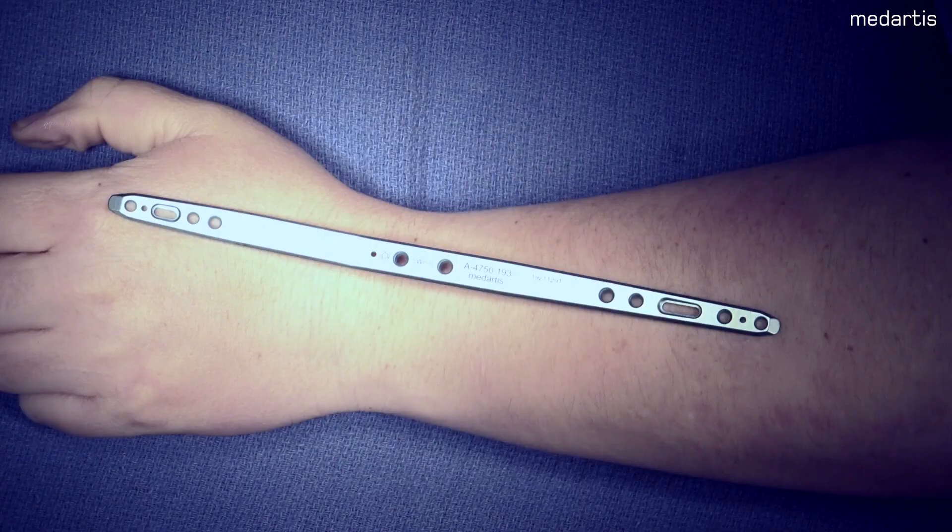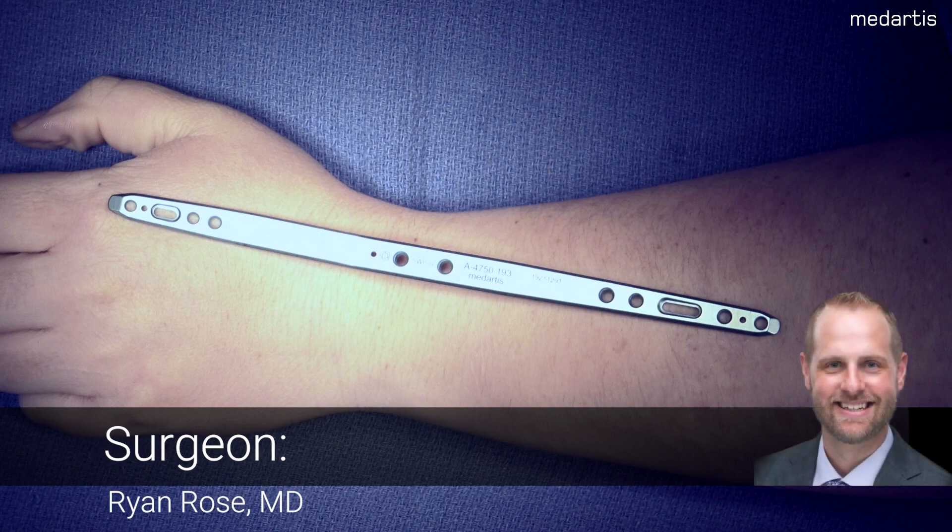Video number seven: 2.5 millimeter tri-lock wrist spanning plate, dorsal. I'm Dr. Ryan Rose from UT Health Science Center, San Antonio. Today we will be discussing the Medartis dorsal spanning plate for fractures and fracture dislocations.